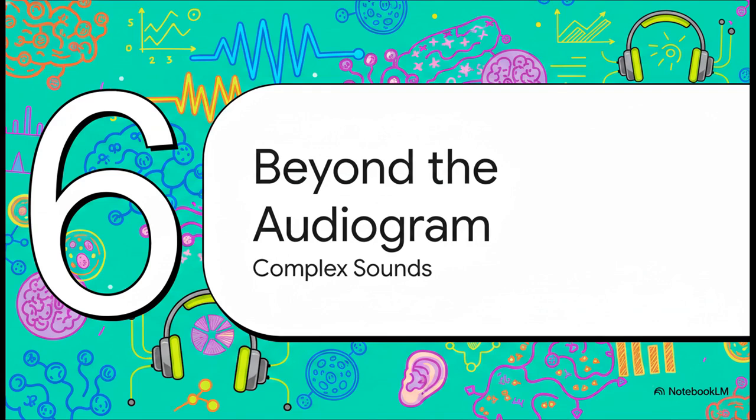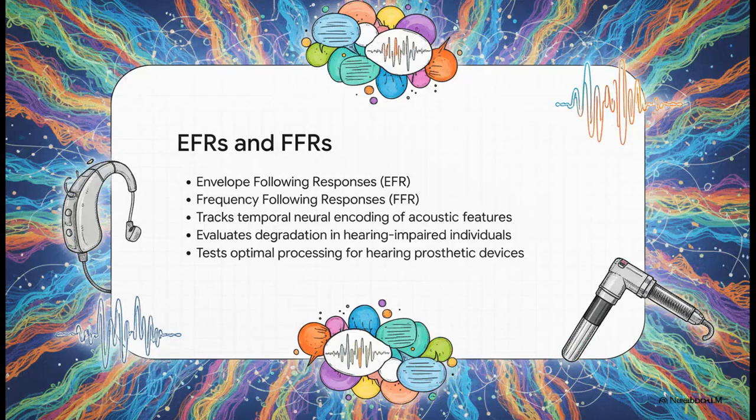Finally, Section 6, Beyond the Basic Audiogram, Complex Sounds. We are moving far, far beyond the simple click or tone bursts now. Today, researchers and forward-thinking clinicians are using envelope-following responses and frequency-following responses to evaluate how the nervous system encodes the really complex temporal features of actual speech.